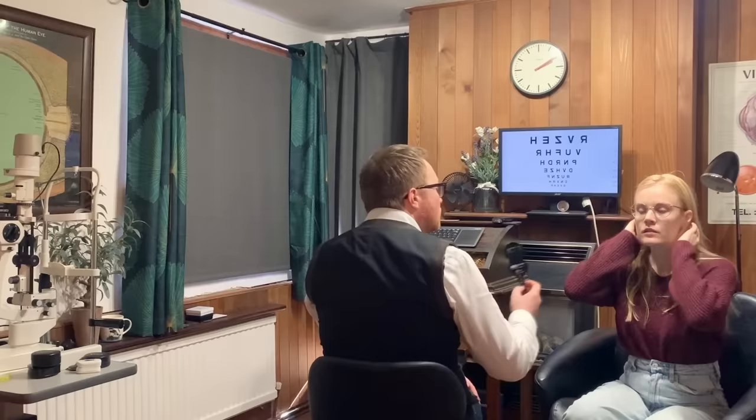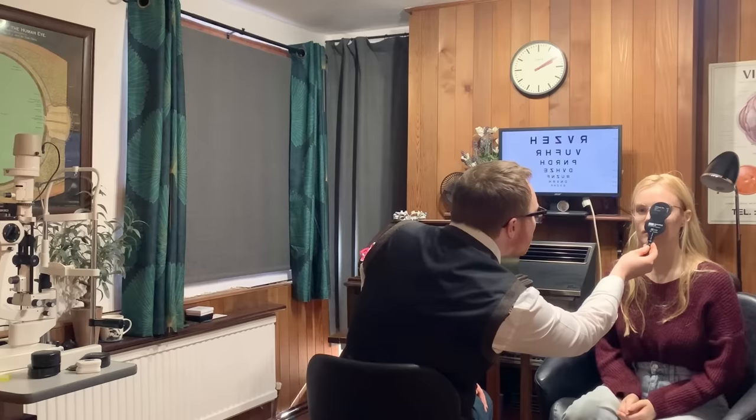And I'm going to get you to have a look at the clock just above the letter chart for me. Just looking at the 6 o'clock position for me at the bottom there. And what I'm going to do is just see how your eye muscles are working together. So I'll get you to keep looking at that little 6 o'clock position there for me. That's very good. Perfect.